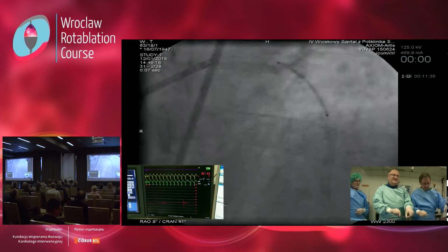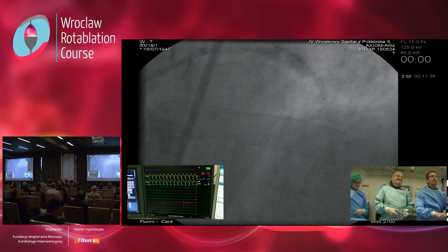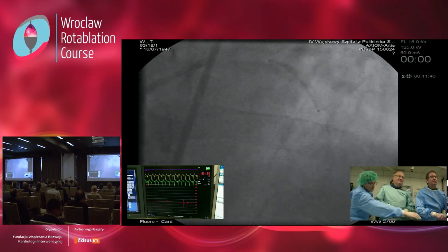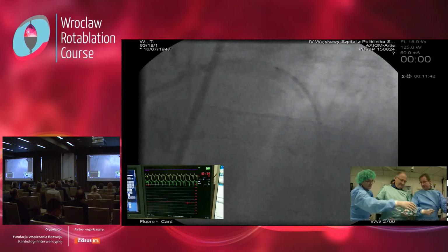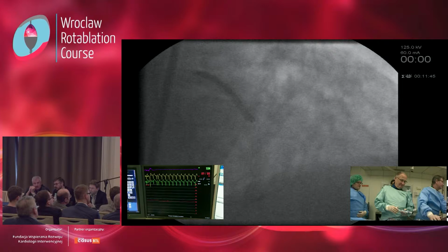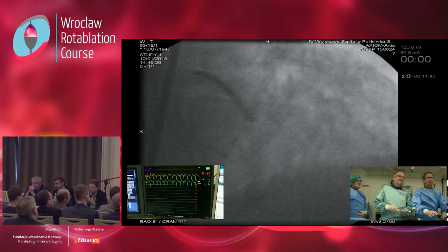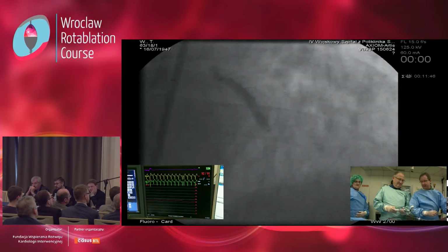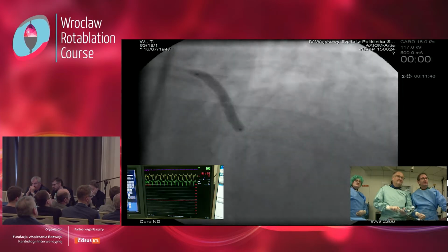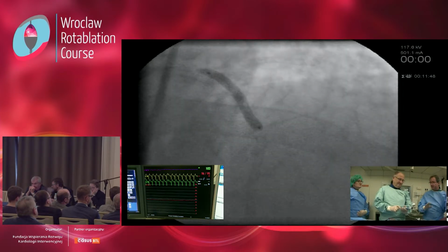No, we haven't. Okay, just go. So Maciek is going now very gently. 2, 4, 6. Don't move, please. Don't move. 2, 4, 6, 8, 10, 12, 14 atmospheres. So we stop.